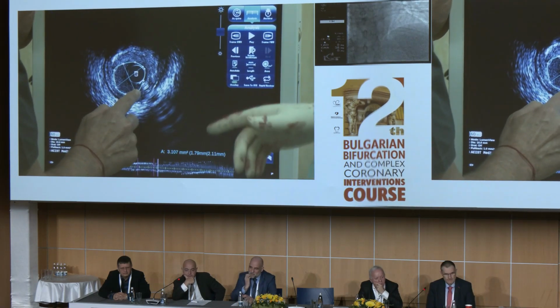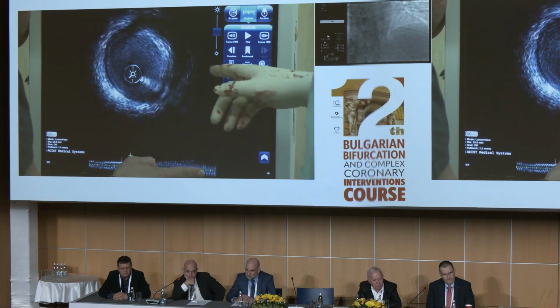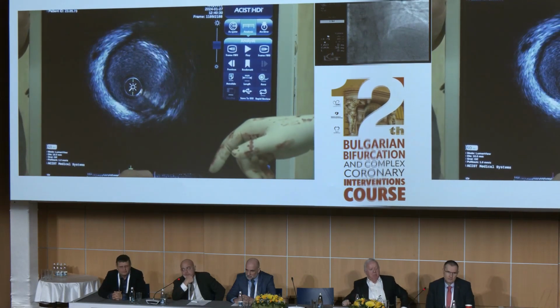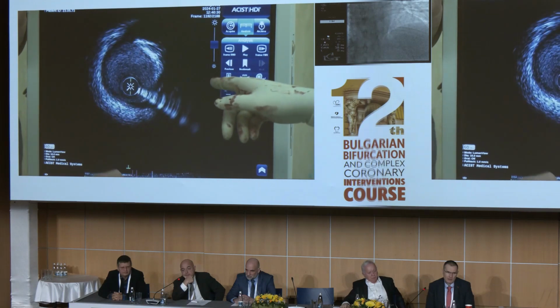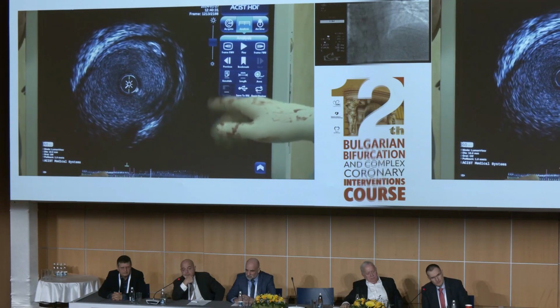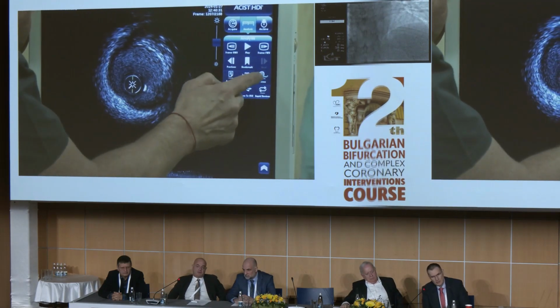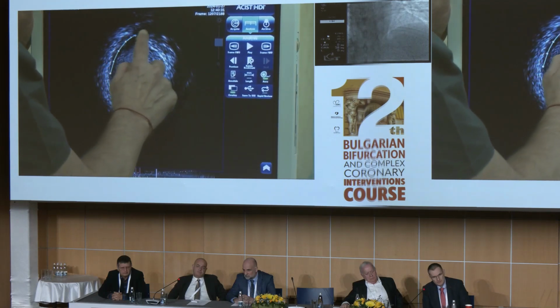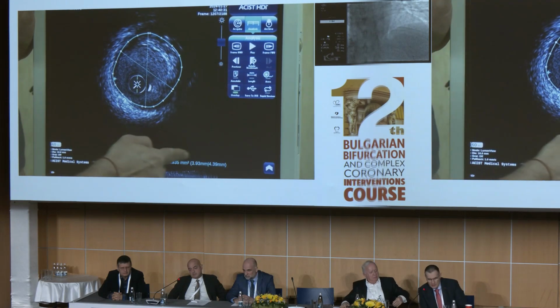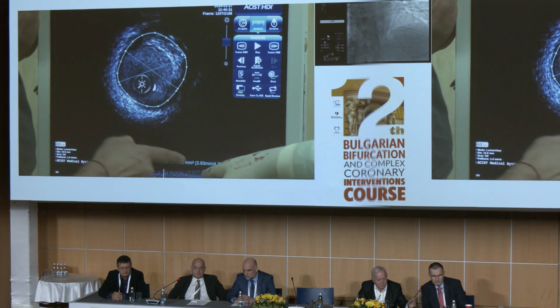Okay, with a huge amount of plaque we can measure the EEL or an approximation of the EEL in the proximal part to decide how big the pot balloon should be. Yeah, here for instance, 4.5. A bit distally. That would be near the circumflex, the left main. Let's measure here the EEL. Just to have an idea. Okay, you can measure the lumen area in this case.